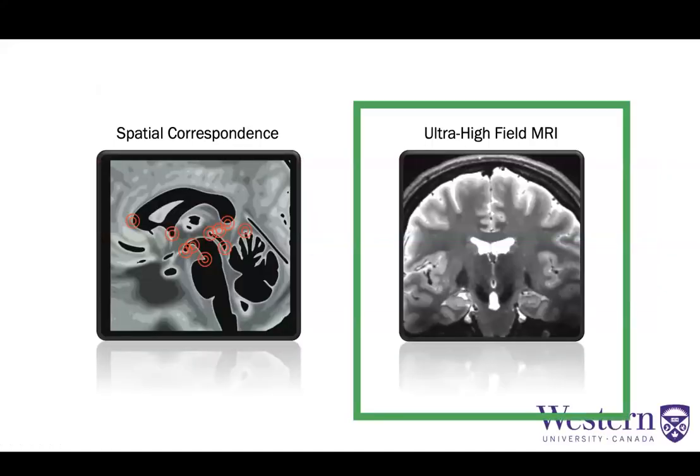And this is certainly impetus. So this is for two reasons I stress that we should start thinking in terms of millimeters if we want to consider the use of these tools for these more extreme clinical indications like stereotactic targeting. But it also provides us impetus to work towards other ways of getting high quality imaging, such as ultra high field MRI.